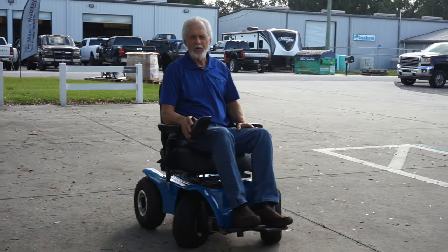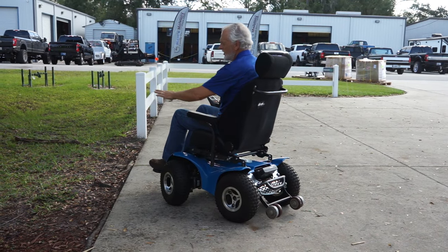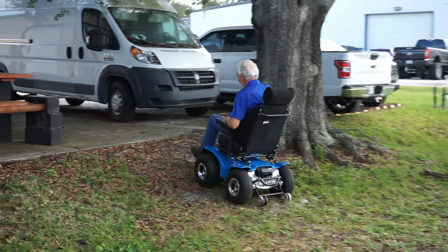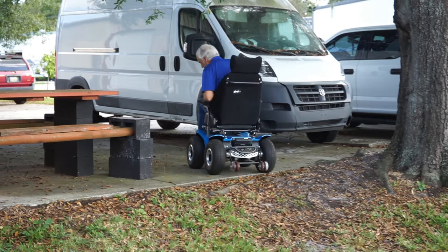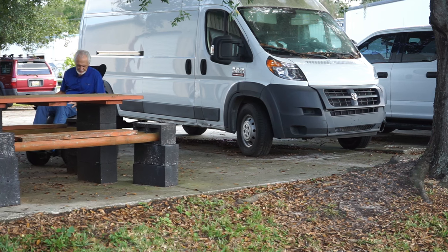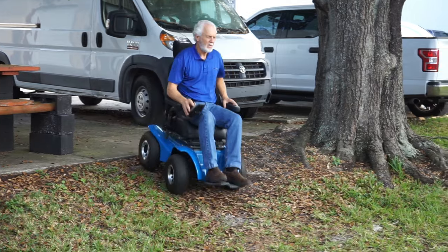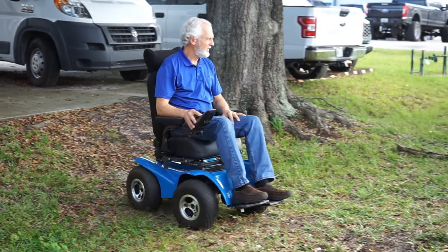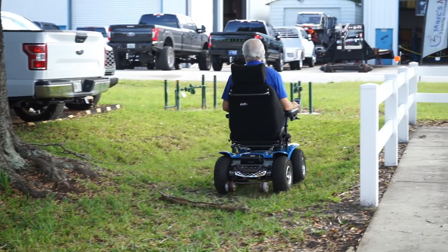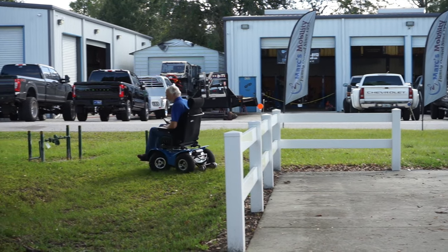As you can see it went over that three-inch tree branch with no problem at all. We're going to go up here and see what it does — no problem at all. This is an extreme power chair. These are so much fun!